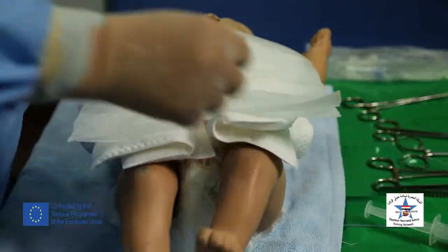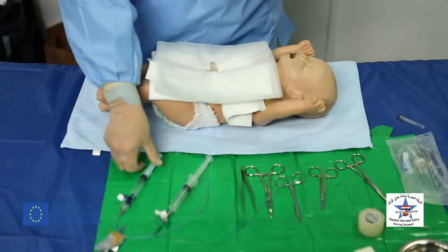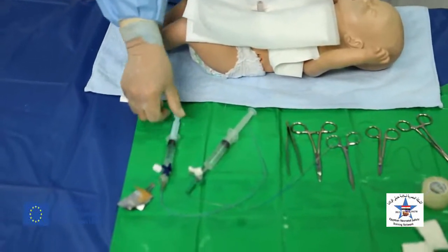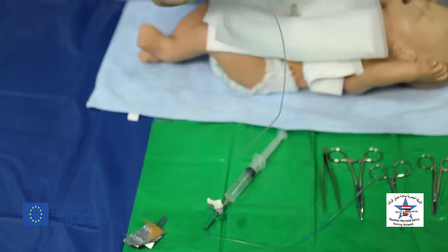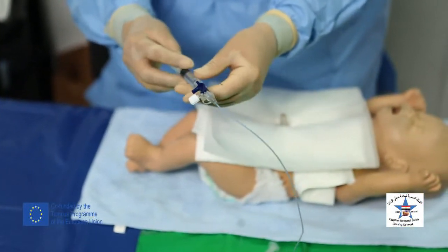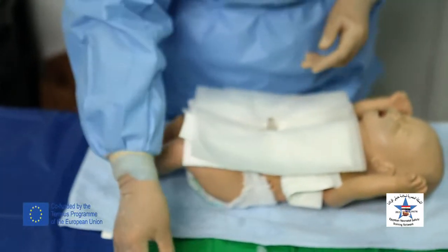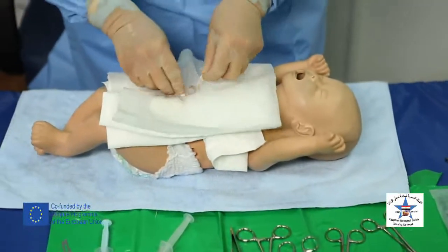Predetermine the length of the umbilical catheter, both artery and vein, the length of insertion, and connect the umbilical arterial and venous catheters both to a three-way stopcock and heparinized saline in a 5 cc syringe. Apply an umbilical tape around the base of the umbilicus.